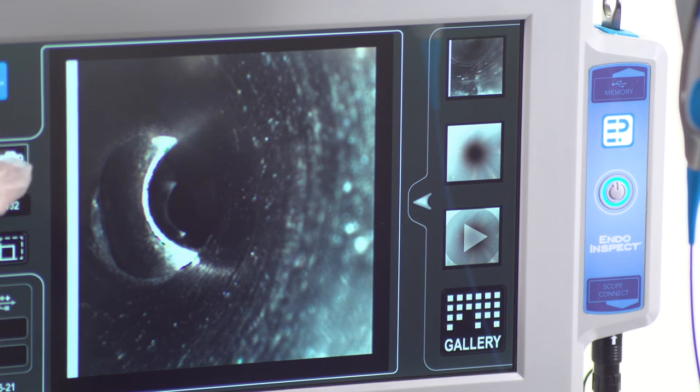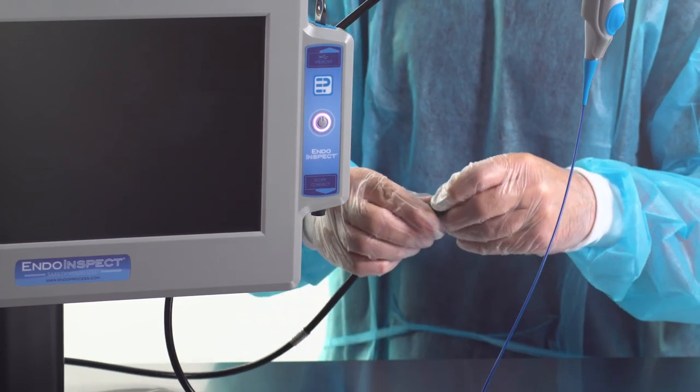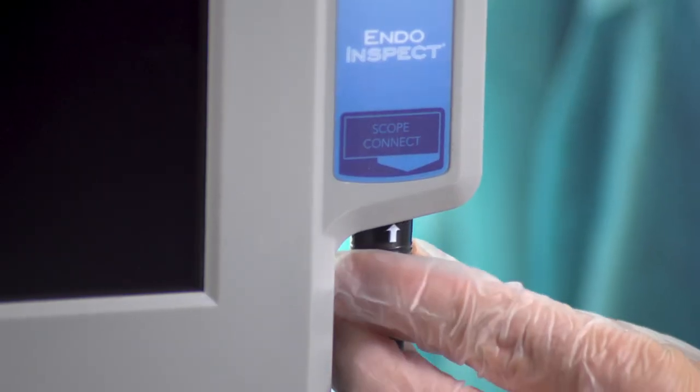Recent captures appear on the right side and you can access the full image gallery for review. Changing to a different diameter Borescope is quick and easy — just disconnect from the system and replace it with the desired Borescope.